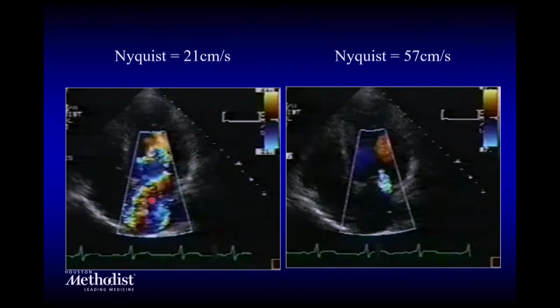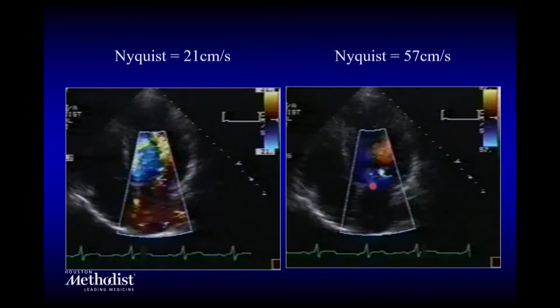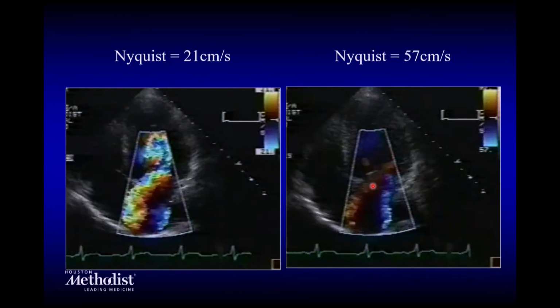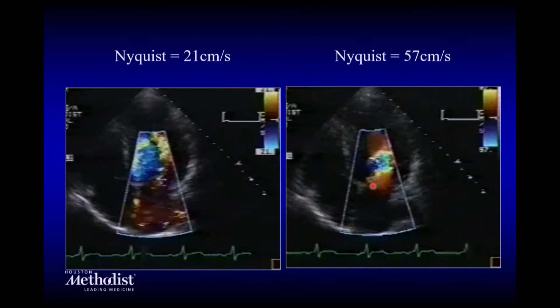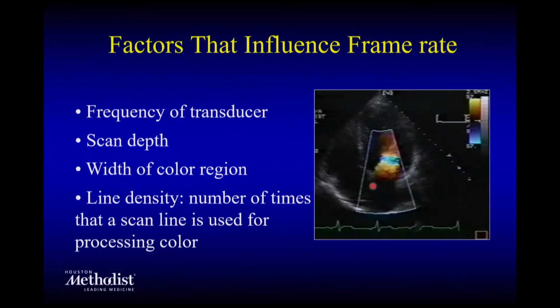Just look how impressive it looks, as opposed to this same patient with a much less impressive mitral regurgitation. So you have to be careful about that, and that's why you need to know the basics of ultrasound. Sonographers, interpreting physicians, it doesn't matter. You have to understand this.